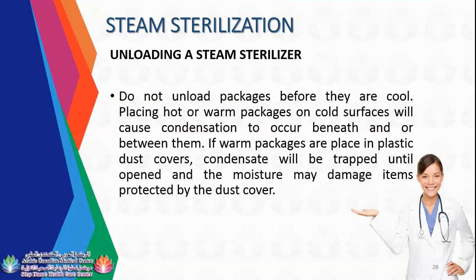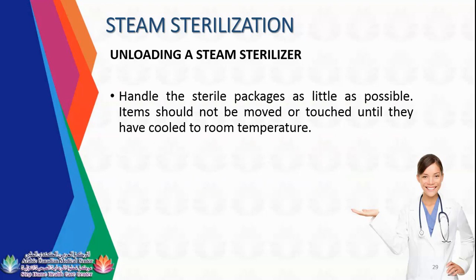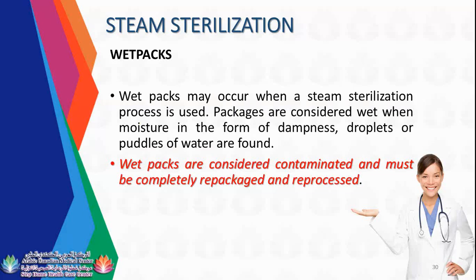Handle the sterile packages as little as possible. Items should not be moved or touched until they have cooled to room temperature. Wet packs may occur when a steam sterilization process is used. Packages are considered wet when moisture in the form of dampness, droplets, or puddles of water is found. Wet packs are considered contaminated and must be completely repackaged and reprocessed.